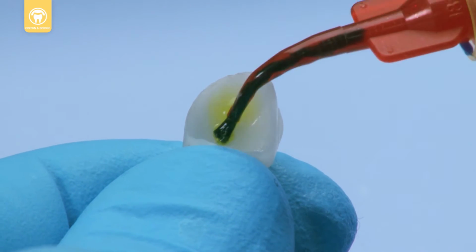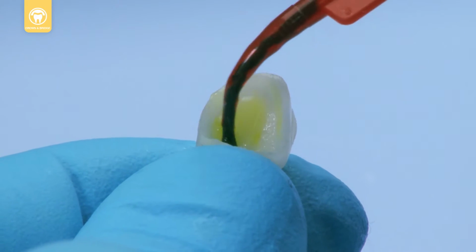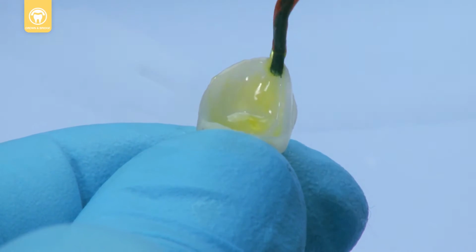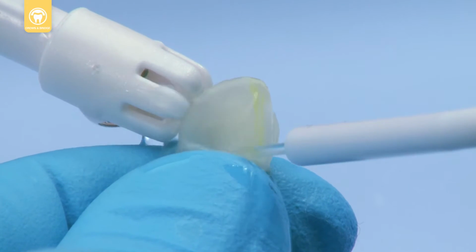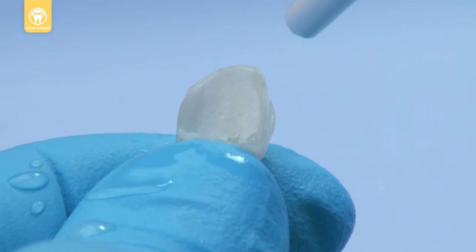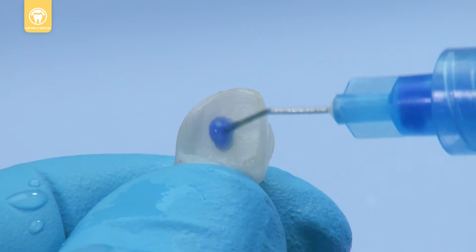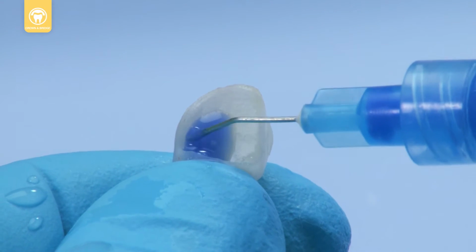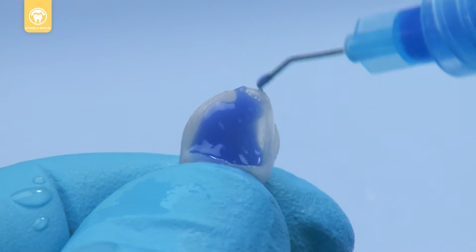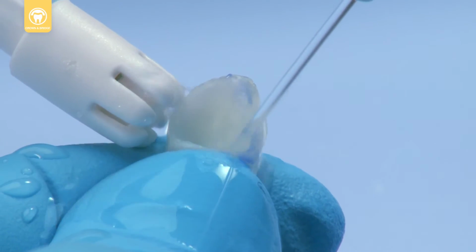Etch the inside surface of the veneer with porcelain etch for 90 seconds. Rinse and air dry the surface. Apply Ultra Etch for 5 seconds to remove the porcelain salts and debris formed by hydrofluoric acid etching. Rinse and air dry again.